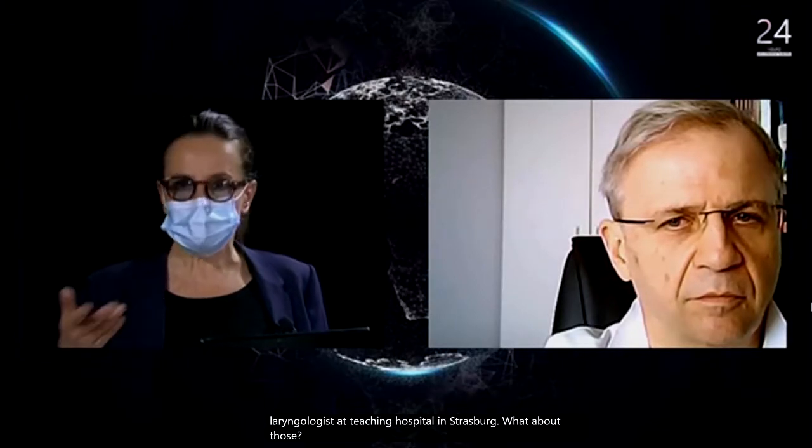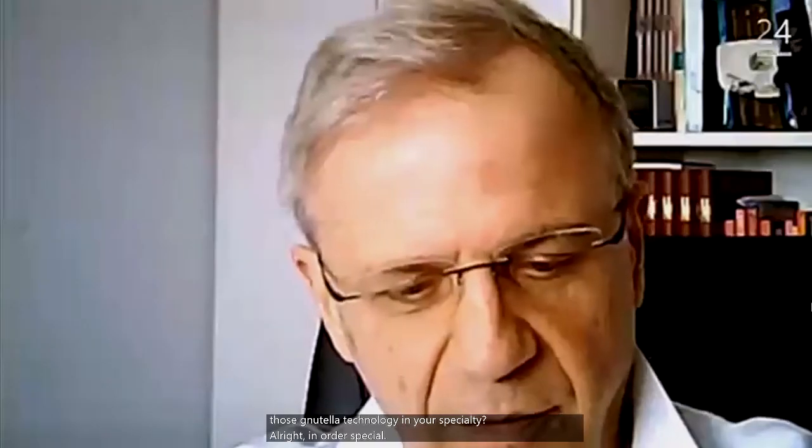And Professor Christian Debris, you are an otolaryngologist at Teaching Hospital in Strasbourg. What about those new technologies in your specialty? In our specialty, I am working in skull-base surgery. There is very little place inside, and we have used for many years a device system which permits to locate the tip of the forceps during the operation. It's very classical.